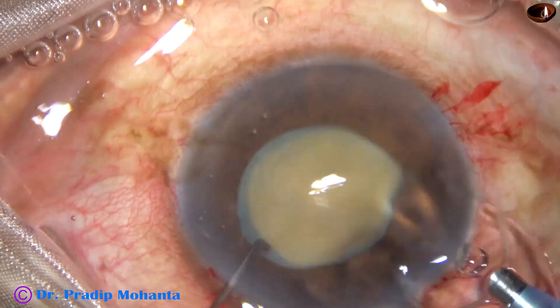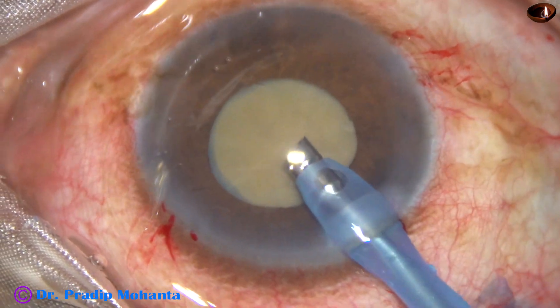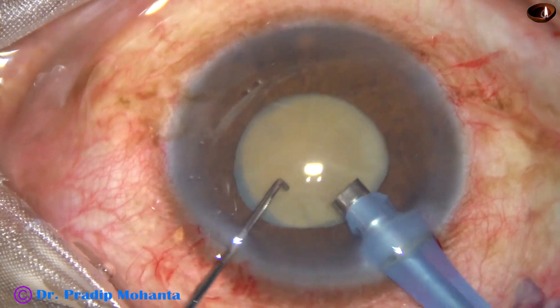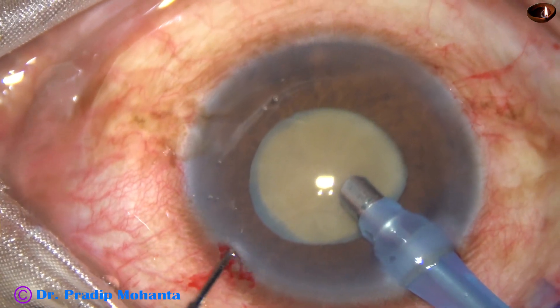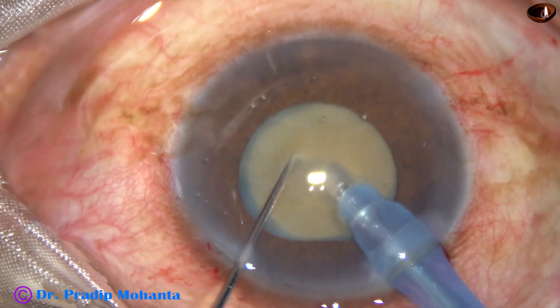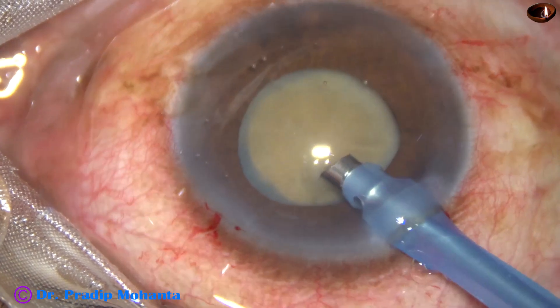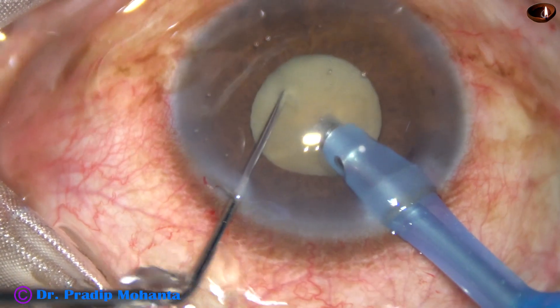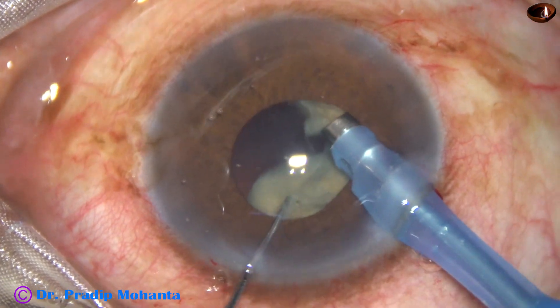Now the tip of the FACO handpiece is introduced. I am thinking how to divide the nucleus — should I go bevel up? But we cannot engage the nucleus with bevel up. So this is a beautiful technique: make the bevel down and the tip gets occluded immediately. Make a tunnel and then come out. Because with bevel down, dividing the nucleus into two is a bit difficult. So make the bevel up again and go through the tunnel. As soon as I go through the tunnel, the tip is engaged — go through the substance of the nucleus for a distance and divide the nucleus.